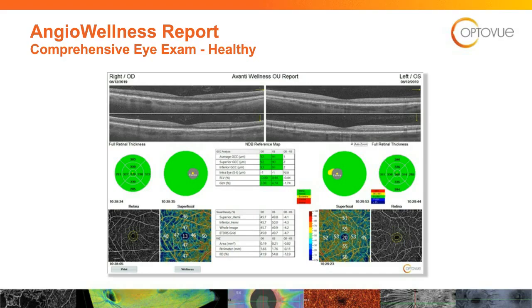I'll click on the wellness button. The beautiful part of this is there's one button that you hit, and it populates and pops up this image right here, all in one report. I can't tell you how important that is. I usually start in the middle. I'll go through my spiel here. As this is opening up, hopefully these numbers that pop up in the ganglion cell complex, along with your pressures for glaucoma, are between 85 and 100. And I would say, well, voila, they are.